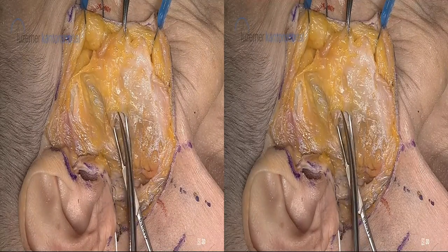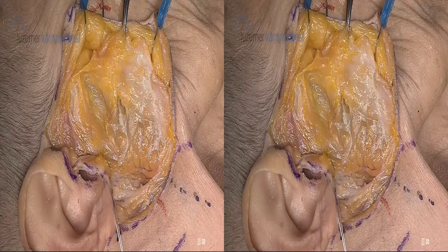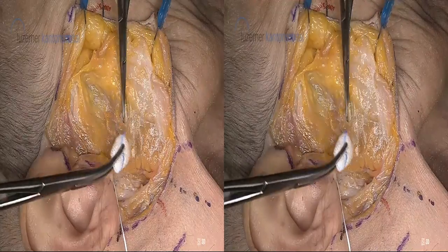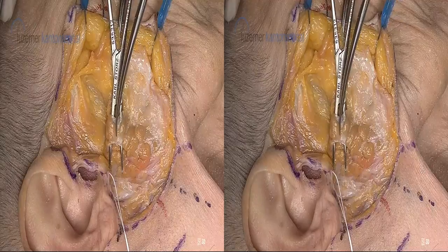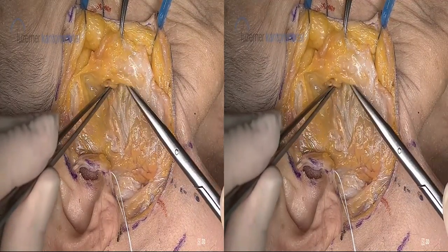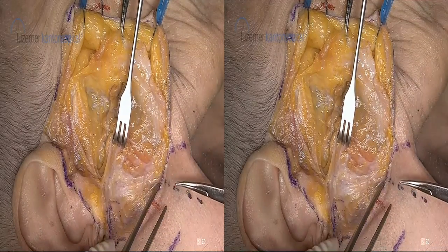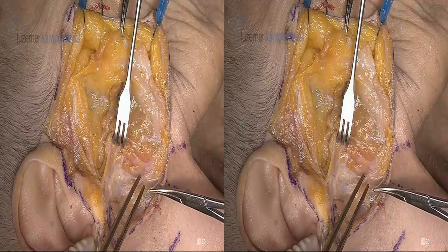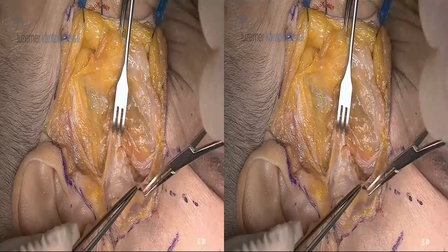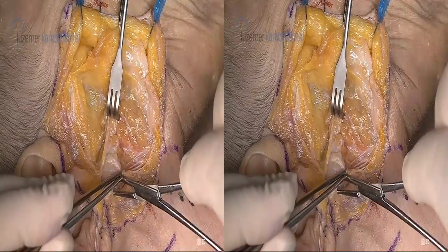We can then follow this nerve branch, staying on the nerve and opening up. We don't want to transect the base of our SMAS flap, so I'm just cutting a little bit here into the area so we can see better here the nerve. We see here one of these nerve branches, and now we can follow this nerve even proximally towards the main stem. We will first identify in this patient the main stem of the facial nerve, assuming that we need to anastomose also towards the main stem. We have found here the greater auricular nerve. Here we can follow the nerve as much in the periphery as needed. And then we go anteriorly along the sternocleidomastoid muscle. There are usually thick ligaments.